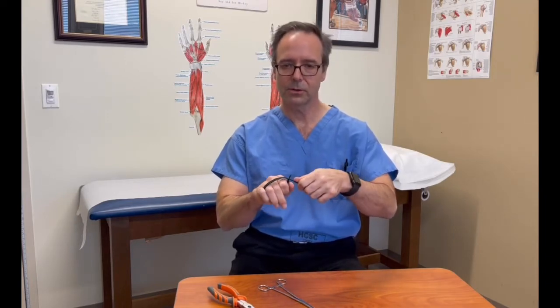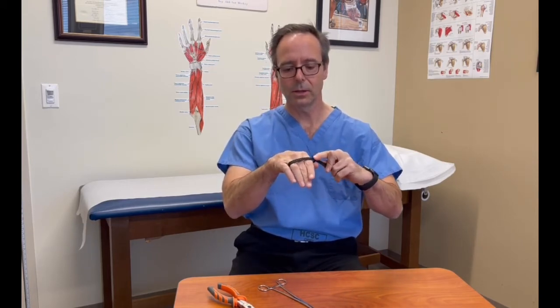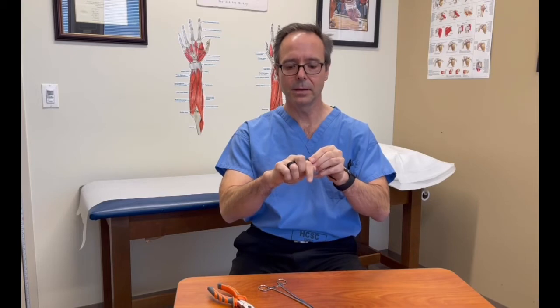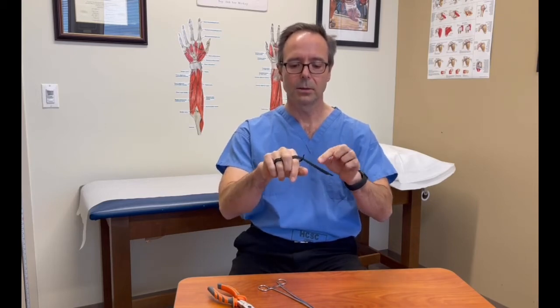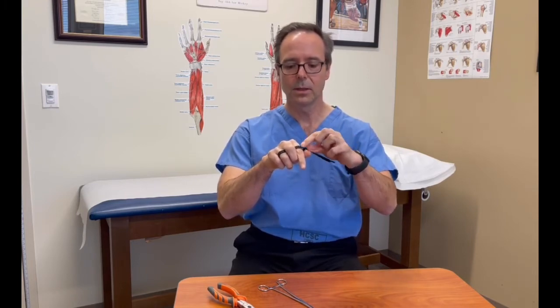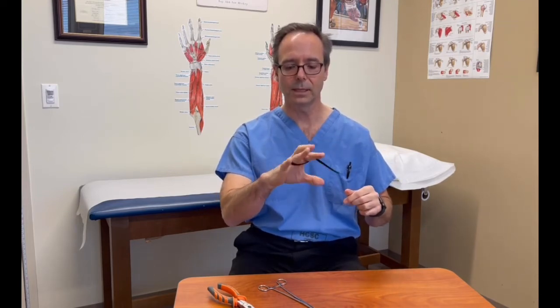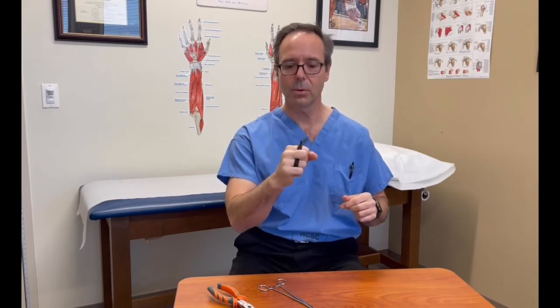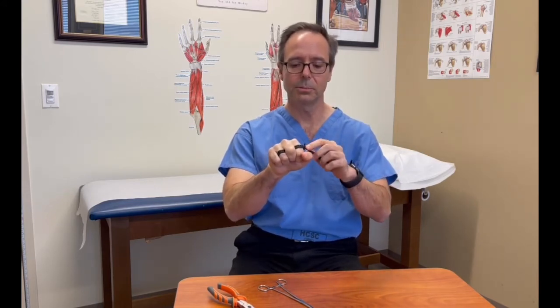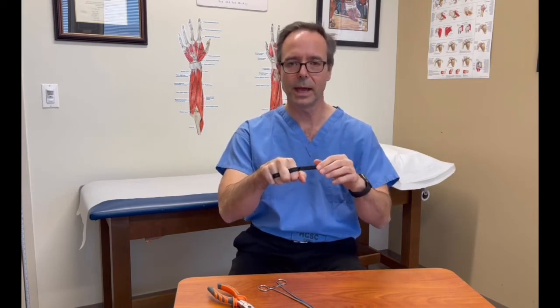So I'm going to choose this perforation, and it's pretty much flush on the hand with a little gapping. Then we're going to test it and bend it right now for sizing. There's enough tackiness of the silicone and enough of a press fit through the perforation that even before bending or locking, it's not going anywhere. We then ask the patient to go ahead, flex and extend, and we check our sizing at that point to see how it fits. My size feels pretty good here, so I'm going to stick with this perforation. But as you can see, if need be, I could just move a hole up or move a hole down if it's too big or too small.